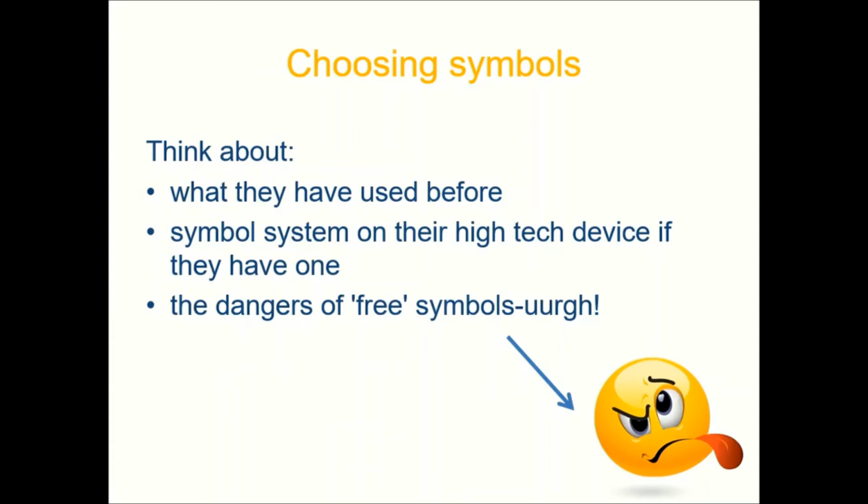So when you're choosing symbols, think about what your clients used before, what they're used to. If they already have a symbol set on their high-tech device, try and make it the same. And just be careful of using free symbols if you don't have access to paid symbol software. Free symbols are free for a reason. They often can be difficult to understand.